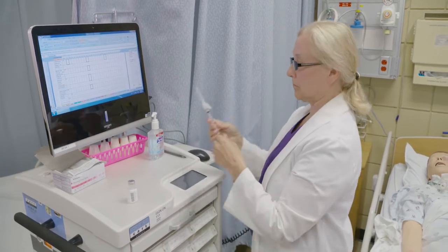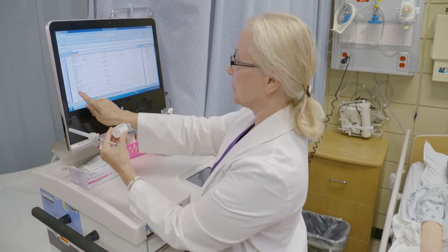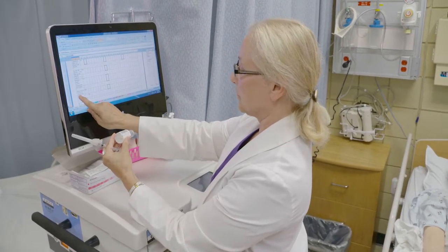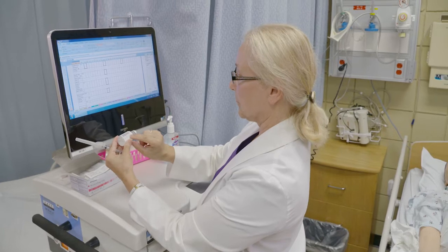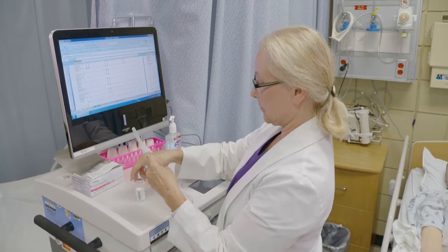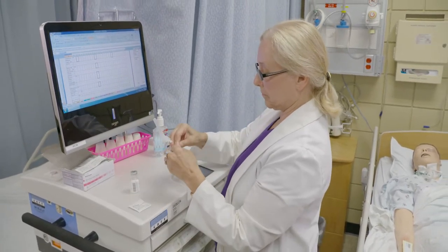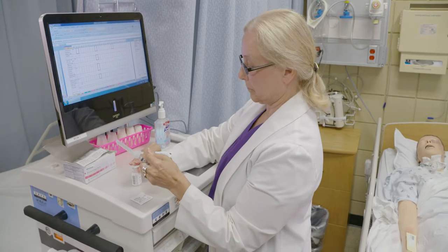Figure out your math dosage with doctor's order to what is on the vial bottle. The order is for 50 micrograms. On hand is 50 micrograms per milliliter. You will need 1 milliliter of medication. Use an alcohol swab and clean the top of the medication vial.